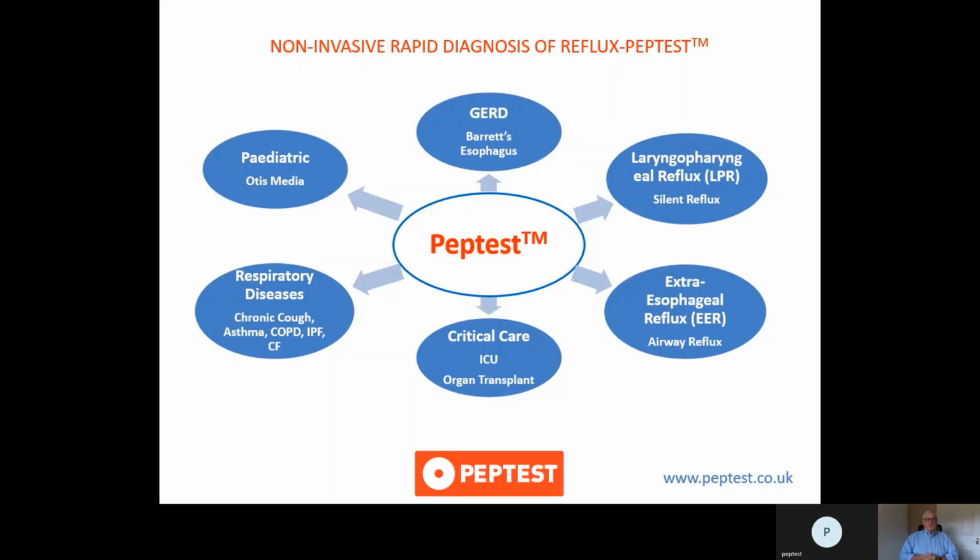This gives you some idea of the range of patients tested, from GERD, which we've spoken about, and laryngopharyngeal reflux, LPR, through to extraesophageal reflux or airway reflux. It's also reasonably commonly used in critical care, in ICU and organ transplants, to see if patients having an organ transplant are subject to reflux disease, and if they are, they have treatment for reflux before they're transplanted. Respiratory diseases we covered, which are chronic cough and asthma.